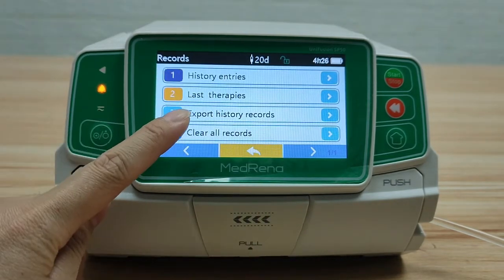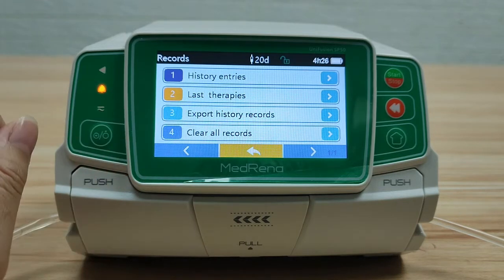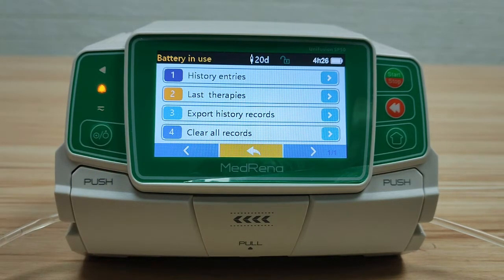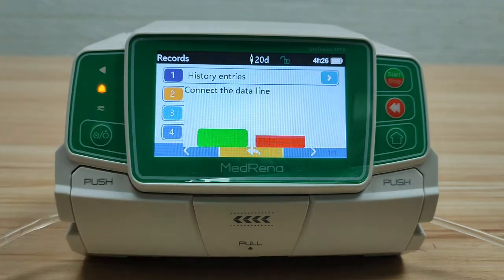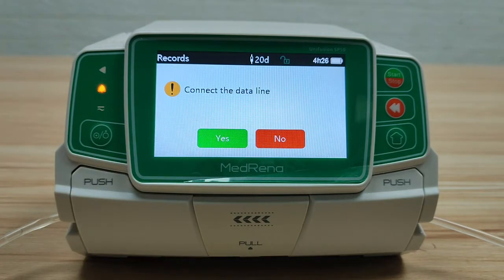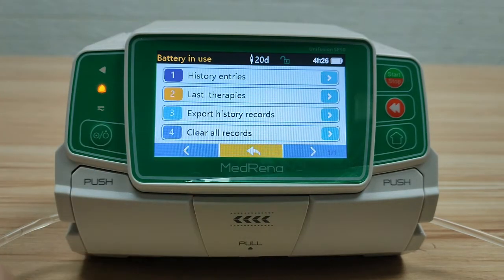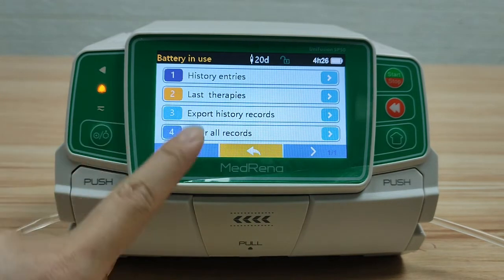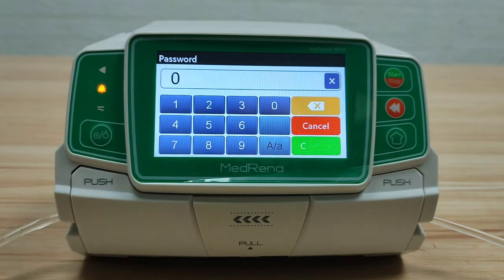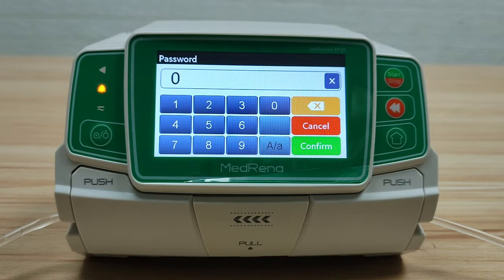Third, export history records: the history records can be exported to a computer using a USB cable. Fourth, clear all records: enter the password 3312 — all data of history entries and last therapies will be cleared.